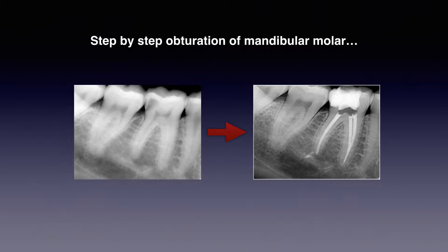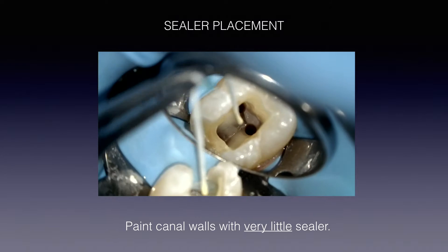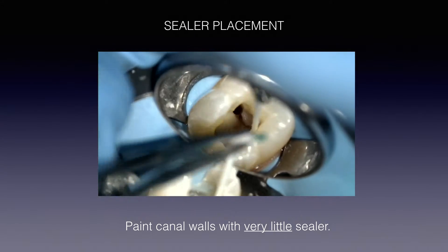Let me show you a step-by-step of a clinical case. Here's a lower molar — the before and after — so let's start off with the sealer placement. Canals are fully instrumented, irrigated, dried. You're good now to obturate. Let's paint the canals with just a little bit of sealer. How much sealer? Less than what you think.